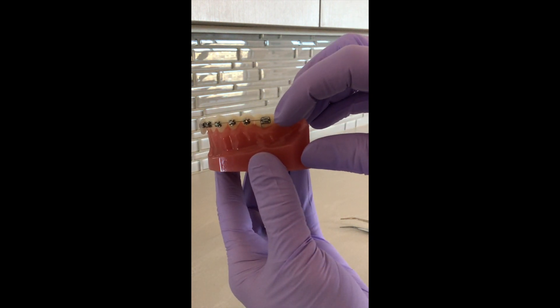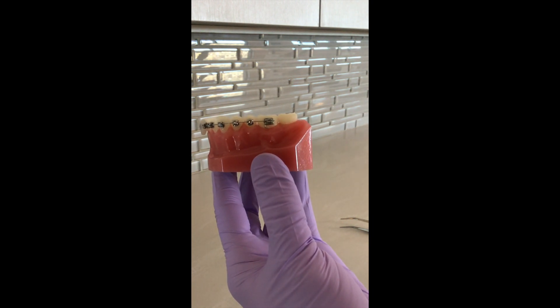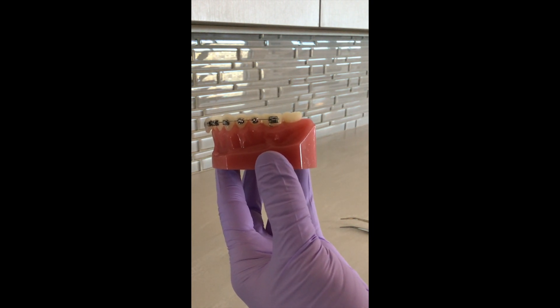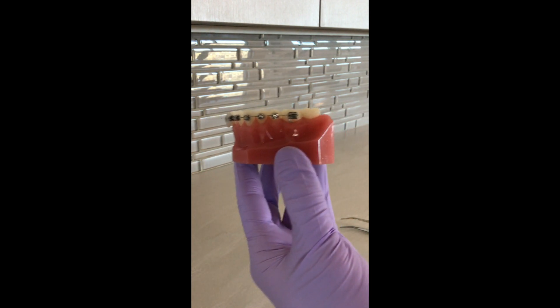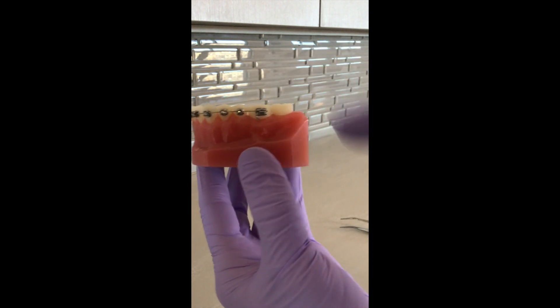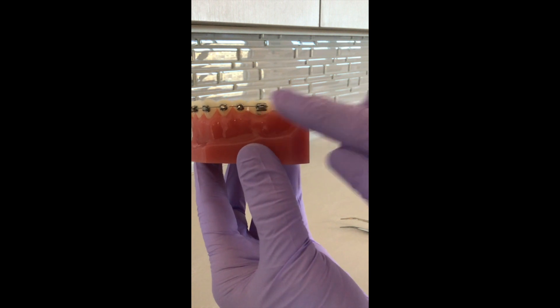Sometimes you may have a little bit of wire poking out back there; a wire might slide a little bit. If it is just a little bit long, absolutely use that wax. You can put that in the back as well—grab a piece of wax and just stick that right on the back to get you through. Usually that will keep people comfortable.